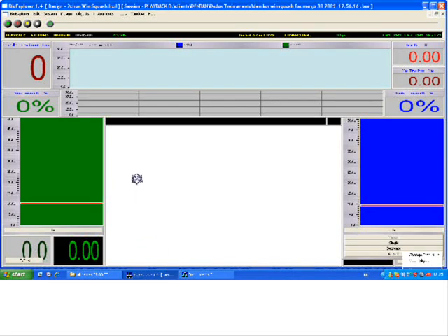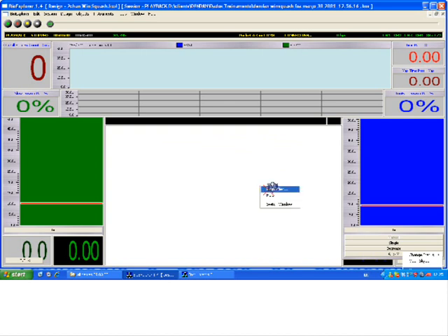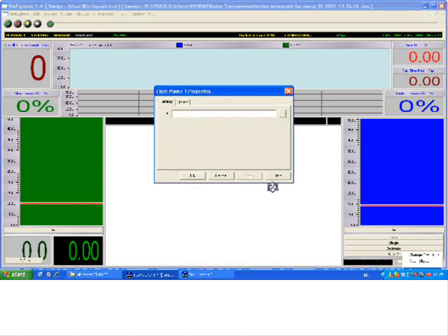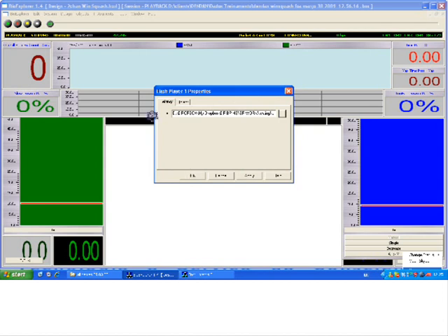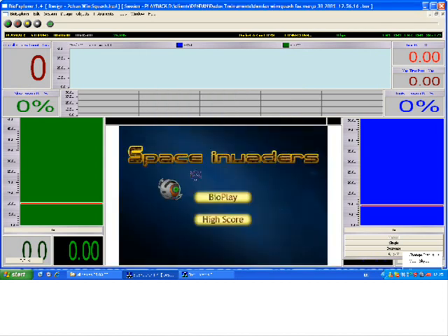Let's walk through the BioPlay game. Here in the design pack — the Italy design pack — there's a flash screen. If I right-click on it, I can choose properties, and the only option is to load a game using the elliptic browse button to the right. I have all 10 games here. I'm going to choose Space Invaders now — it could have been any one of them. They follow a standard, and that's what I want to show you.